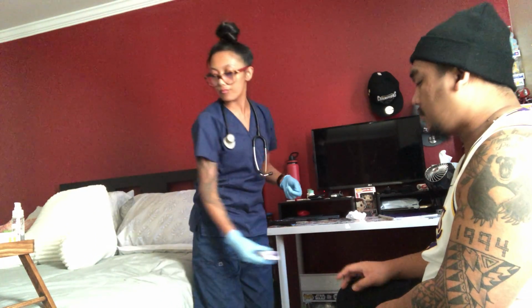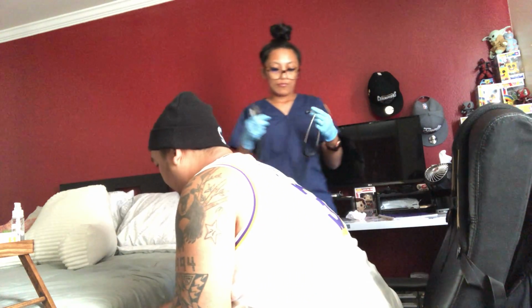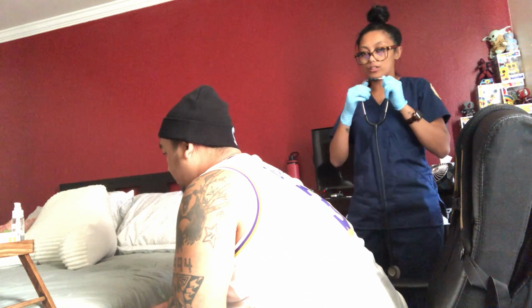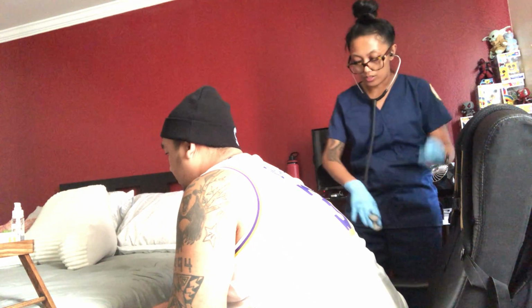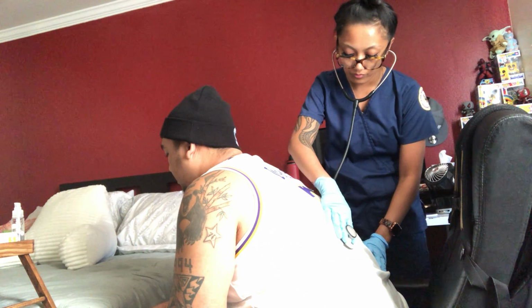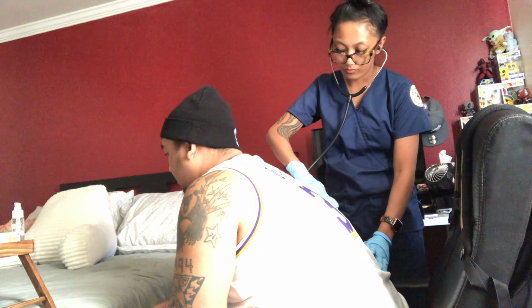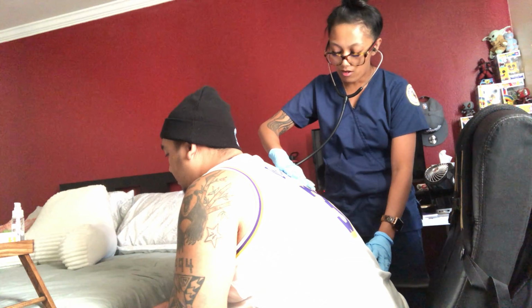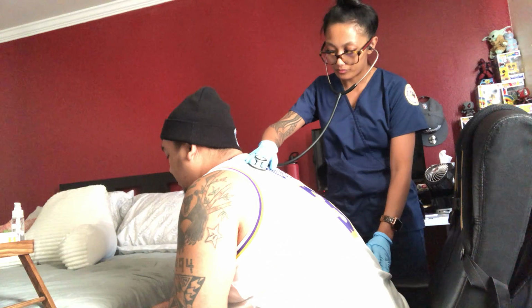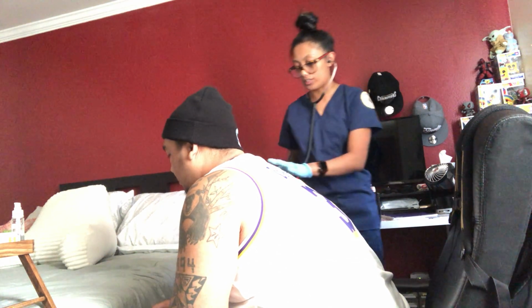Usually I would go underneath the clothing, but in this case, I'm just going to go on top of the clothing real quick. Just breathe normally, okay? Okay, go ahead and listen to the front.